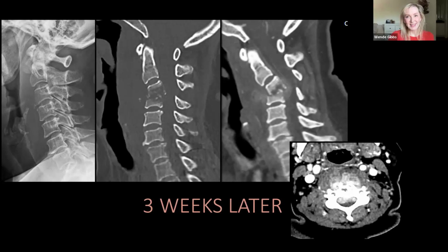One other point from this slide that I didn't think of till right before I got on here, because I was looking at this first slide, is moving patients. You all probably think about this because you are operating on them, but maybe for the radiologist: there's an even greater kyphosis here than there was here. So we need to be safe when moving patients with unstable spines. Maybe that's for radiologists, if any are watching.